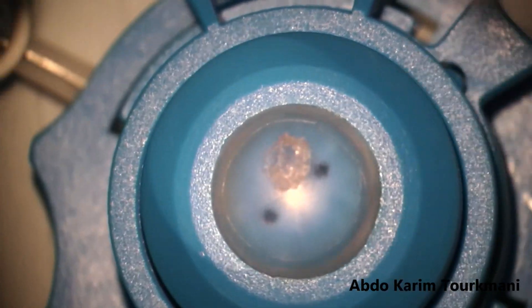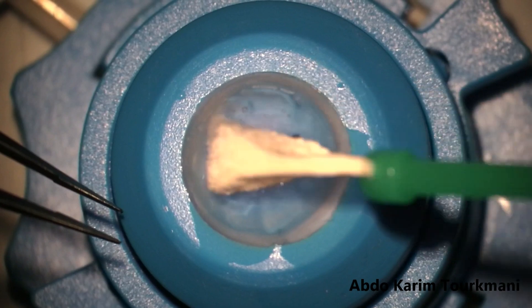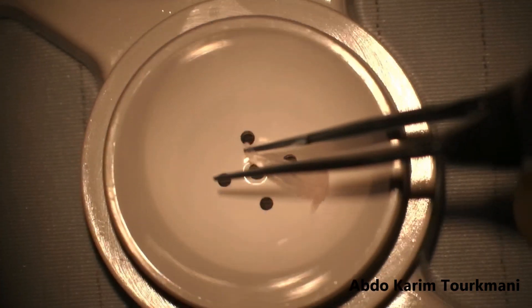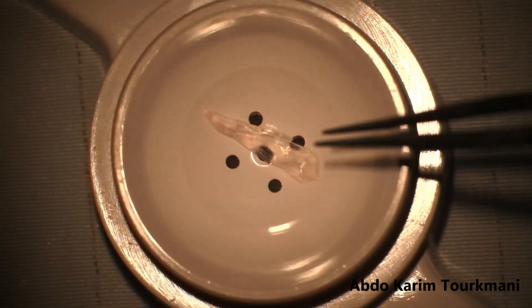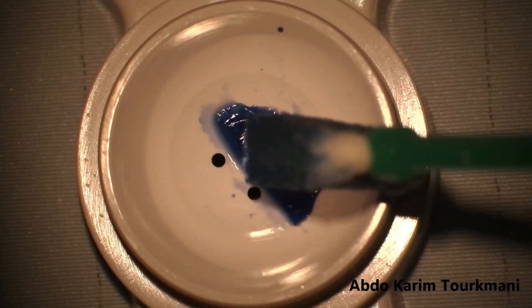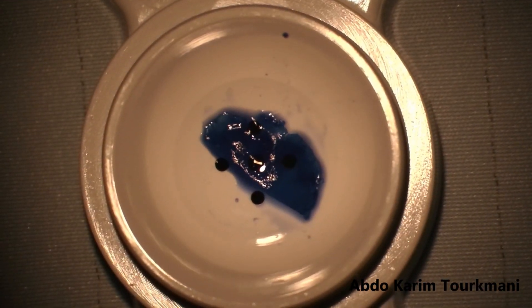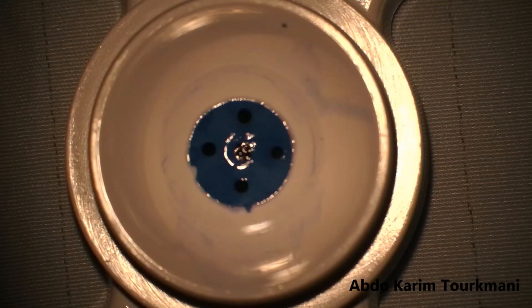When the full layer has been peeled off, the rest of the procedure is as per the original technique. I expand it again, explore it, stain it with Vision Blue, and refine it to the desired size. In this case it was an 8 mm graft, and then put the tissue in BSS, and you can see a nice Bowman scroll, which is now ready for transplantation.